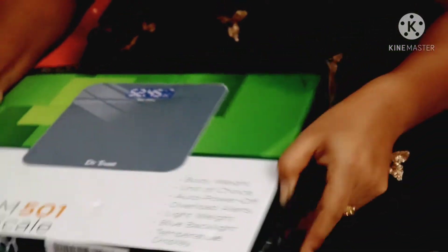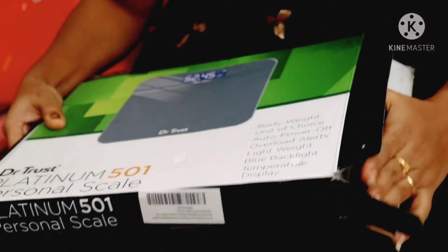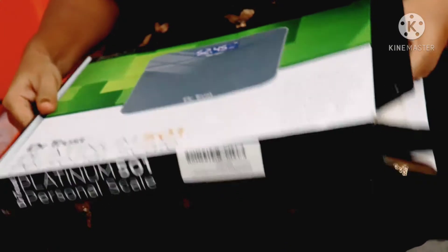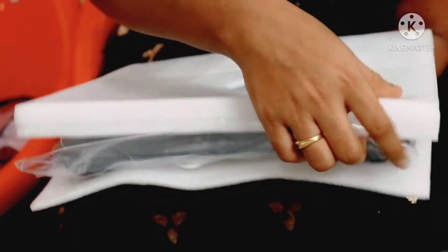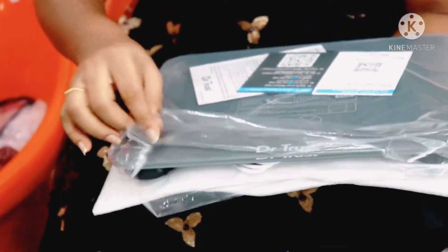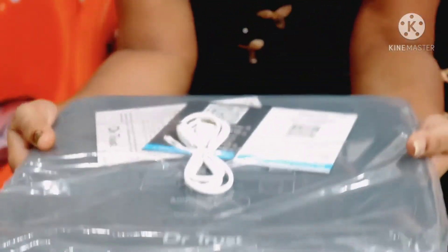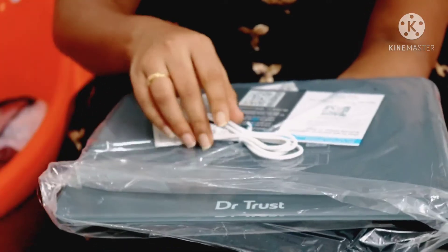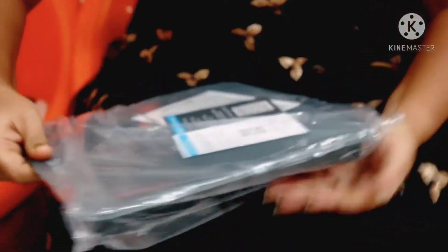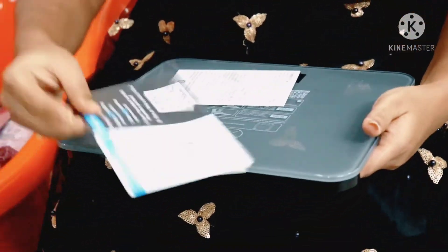So we can unbox it. We are using the package. Here we are going to open the box. And this is the packing machine. This is the charging cable. This is the weight machine. This is the warranty card.